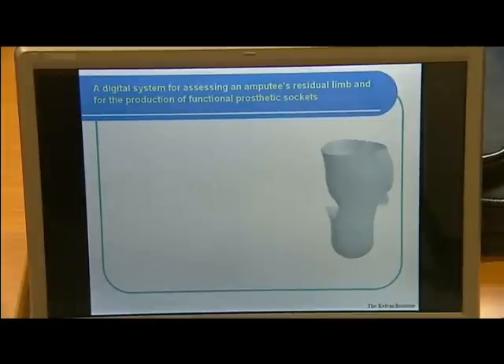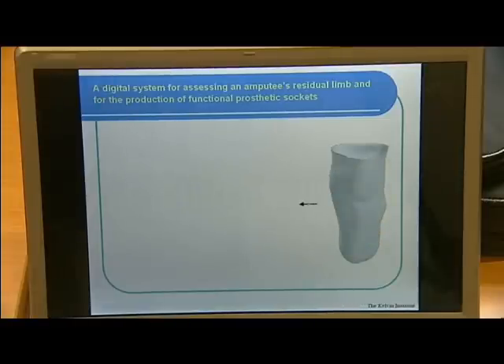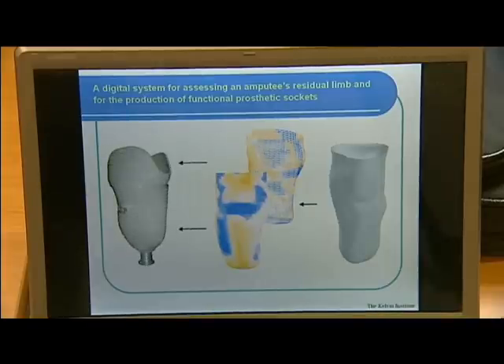Here in Dr. Kapatos's computer simulation, you can see a typical stump. With his new ultrasound technique, he can produce a map of the bone, muscle, and fat. Using this, he can work out where to place the pressure — bone ends become very tender and can't take too much, but the muscles can. The result is a perfect fit every time.